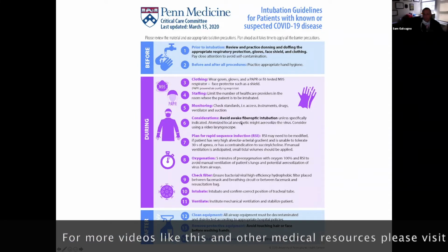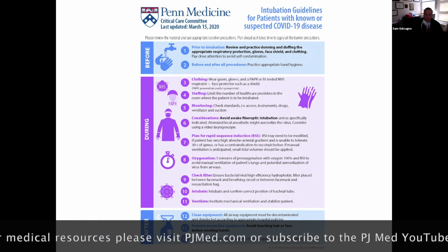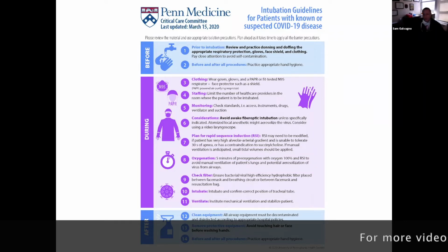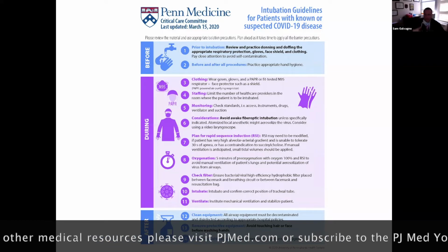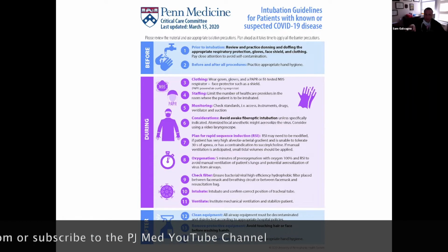For these patients, it is a true rapid sequence induction and intubation, and I know you guys know how to do that. I'm not going to harp on that. How are we pre-oxygenating them? There's a bunch of stuff out there. MCRIT has some fairly sophisticated, kind of high-end stuff. What we're doing here in my county for EMS, we're just teaching the guys to put a mask on for 3 to 5 minutes with 100% FiO2. We're not doing the nasal cannula because that's extra aerosolization. We're going right back to old school pre-oxygenation, and then it's an RSI, and I'll show you some pictures here.